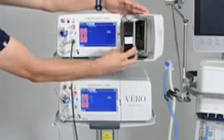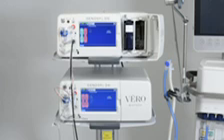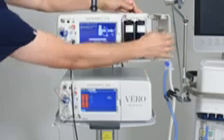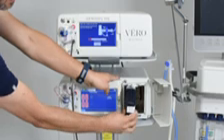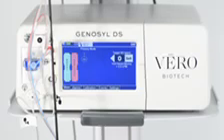Open the cassette access doors and insert 2 cassettes into the dosing console, and at least 1 cassette into the backup console by pushing the middle of each cassette until it clicks, indicating proper seating. The consoles will acknowledge that a cassette has been inserted.